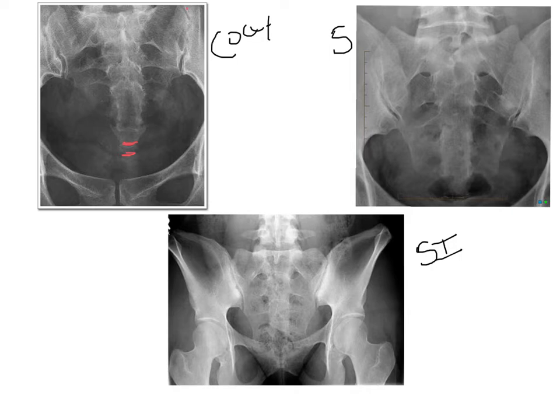So going back to anatomy, we have SI joints here and here. We have sacral foramina. Now, you're not going to see all of the sacral foramina like you do on an AP sacrum. You've got your obturator foramina. This bone right here are your pubis bones. Okay, and below them, right underneath here, are the ischial bones. Pubis symphysis, and between the two, this of course is sacrum.